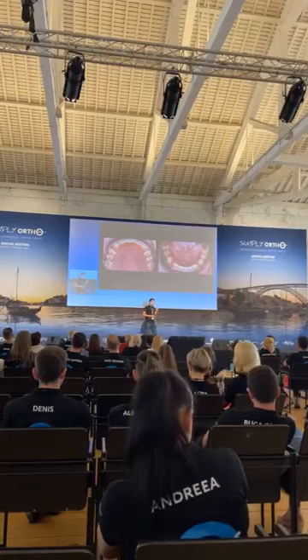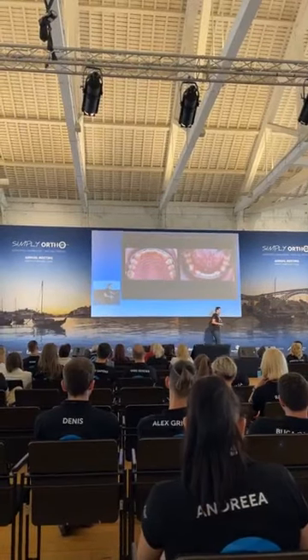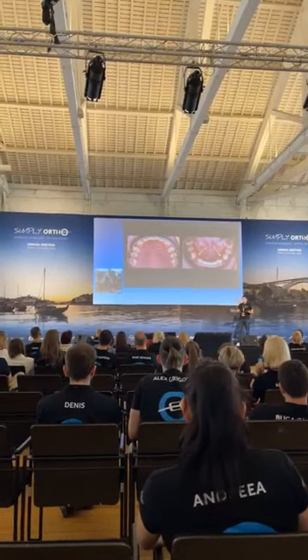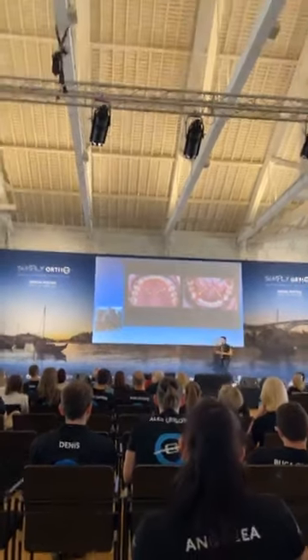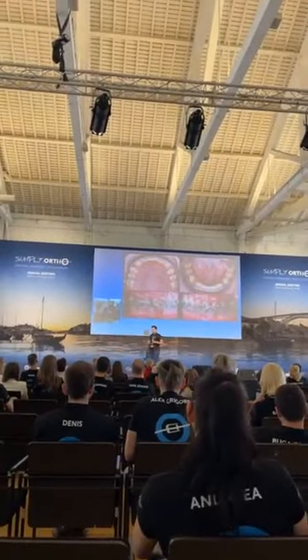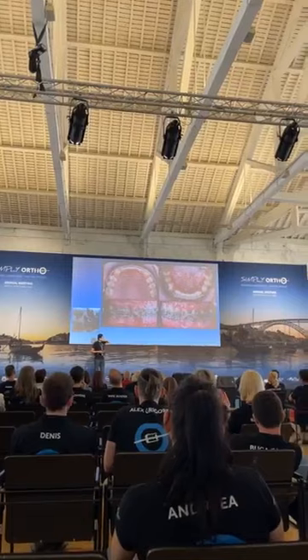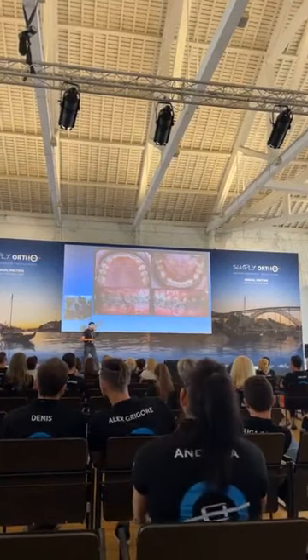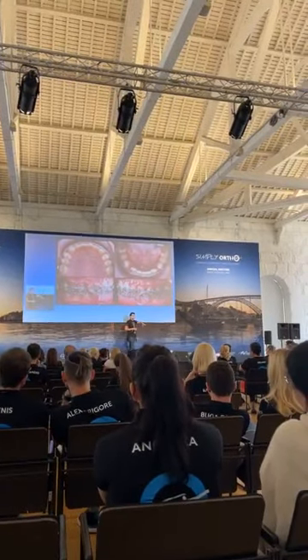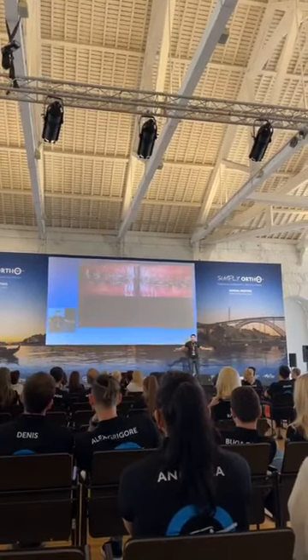After one month, the space is closed. Now it's time to rotate the upper incisors and lower incisors, and start to retract the first premolar — then by chain retract the second premolar. So now, ligating the anterior teeth by the initial wire, starting to retract the first premolar in both upper and lower arches. You can focus on the molar relationship — the molar relation was Class II. I'd like to finish the case with Class I molars and Class I canines. The anchorage in the upper should be maintained similarly in the lower.